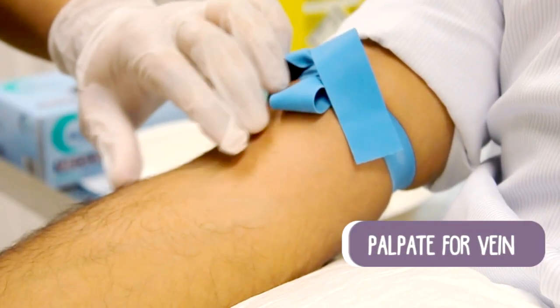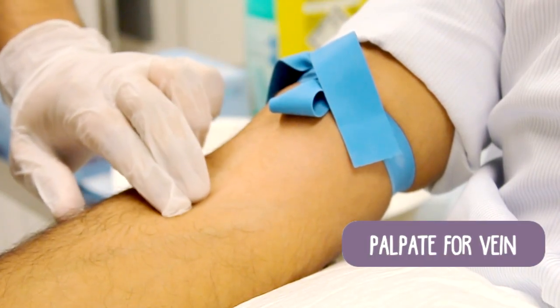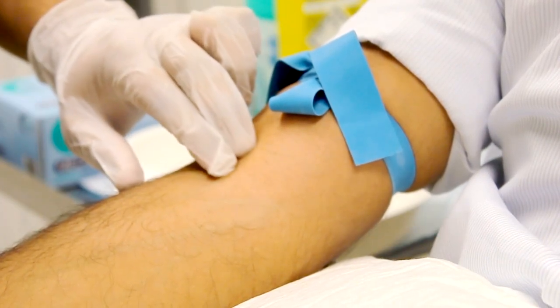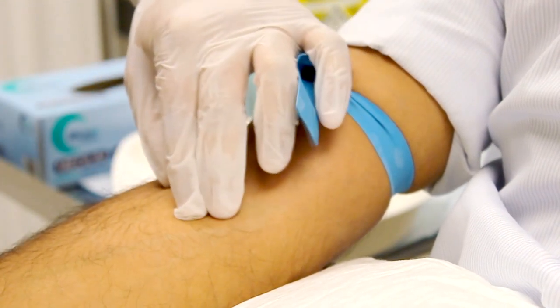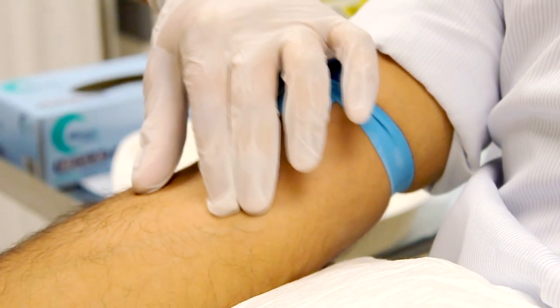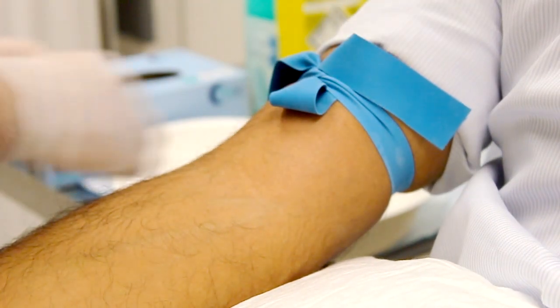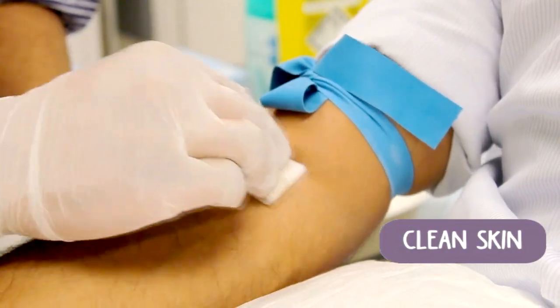The next part is trying to find the right vein to take blood from. This can be more of an art than something simple to teach, but the important techniques are that you have to feel along the course of the vein, trying to find the direction of the vein. It's more about what you can feel rather than what you can see. Once you've chosen the vein, give the area a clean with a chlorhexidine wipe.